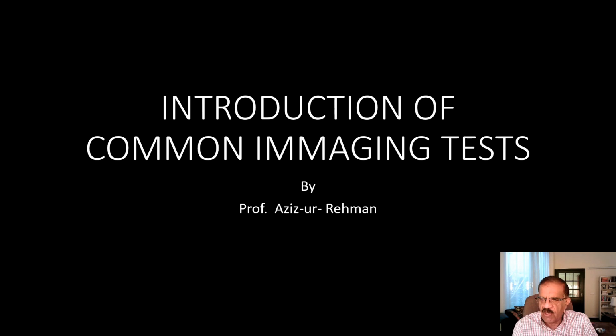Some tests are readily available and are cheaper. Others are a little expensive and are not readily available. So that is another reason why we need to understand which test can provide the information we need for the diagnosis. So today I'll just give you a very brief introduction of various imaging tests available.